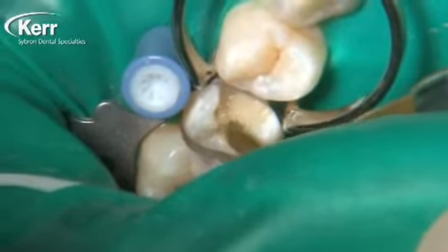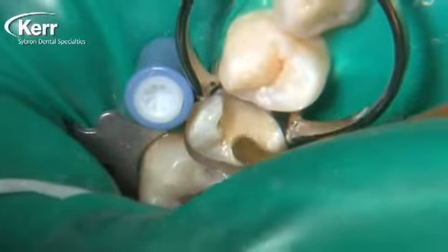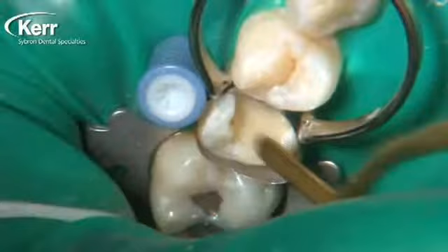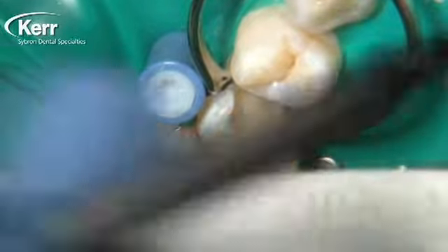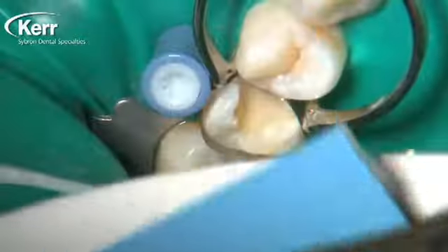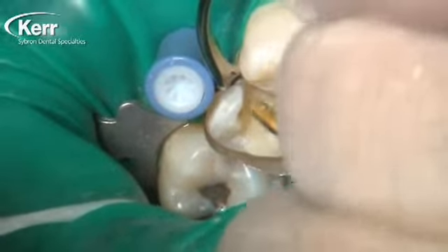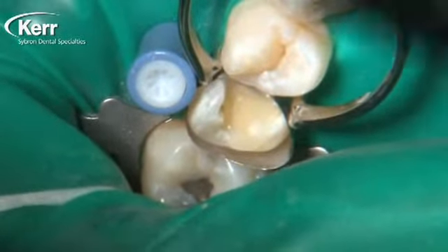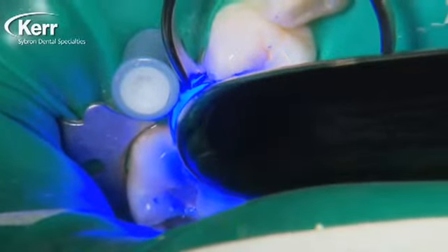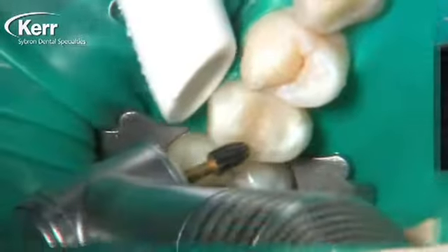Now we just treat it like a typical direct composite and place our composite on top — this is Herculite Ultra. One of the frustrating things for me with direct composites over the years has been post-operative sensitivity. I always felt it came from the step after etching and rinsing, before the bonding agent, where we had to leave the dentin moist. Dentists would ask: what does moist mean? Should I use a cotton pellet, a little air, or high-volume suction? I had to be honest and say I had no idea. With Vertice Flow and the ability to dry the dentin, I can't overstate just how important that is.